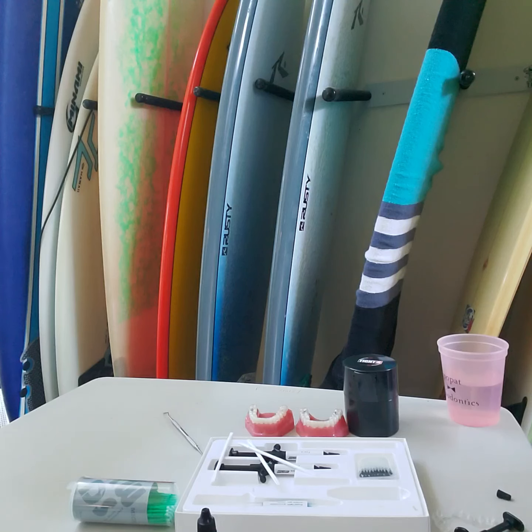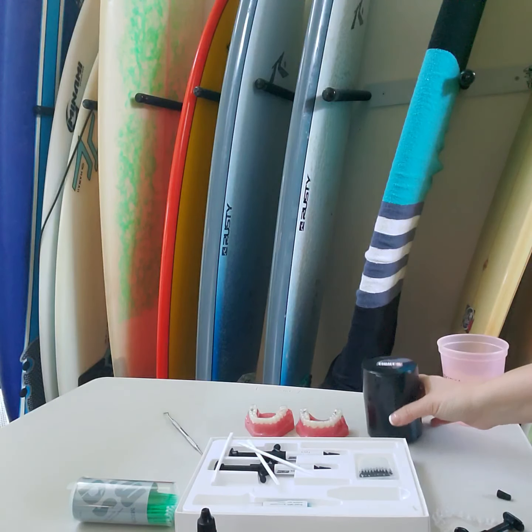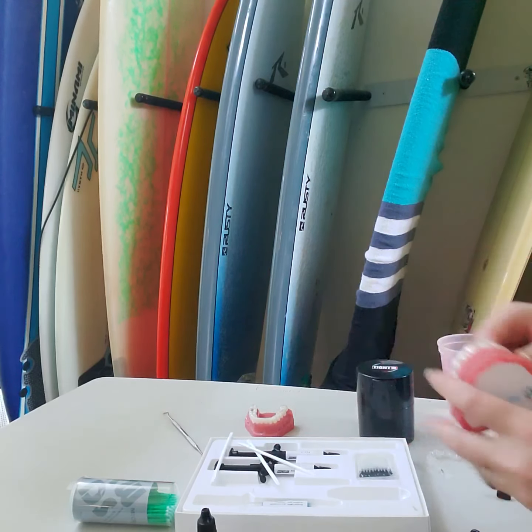boom, done, okay? And if you're going to be a little pokey and slow, I would get two of these, one for upper and one for lower per patient. That way you can just put it in there and let it go. And then when it's time to deliver, it's already preloaded.